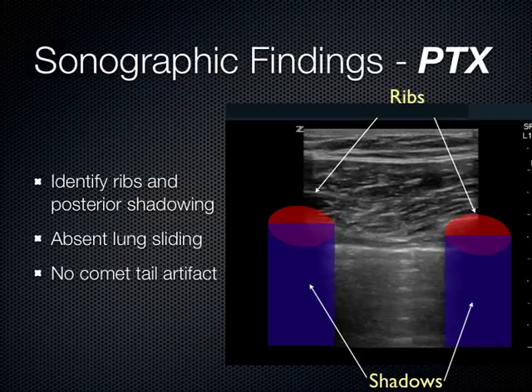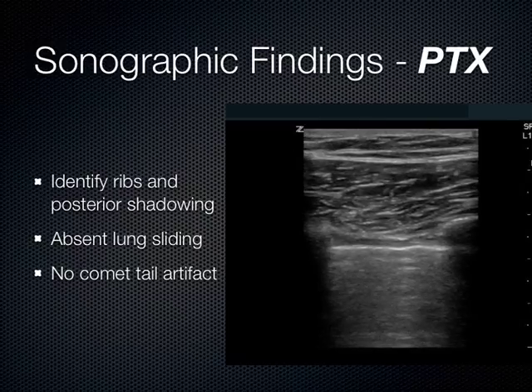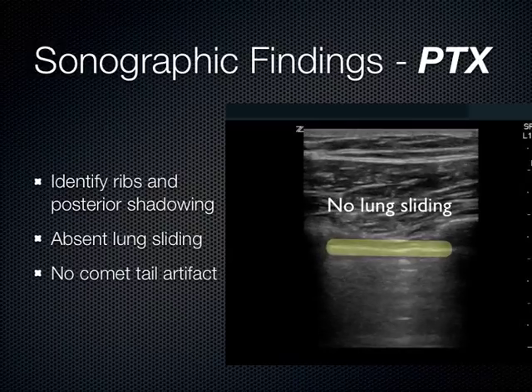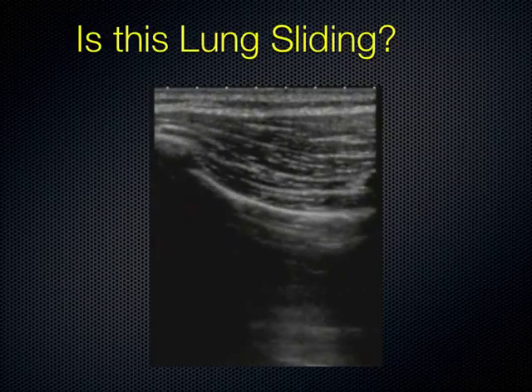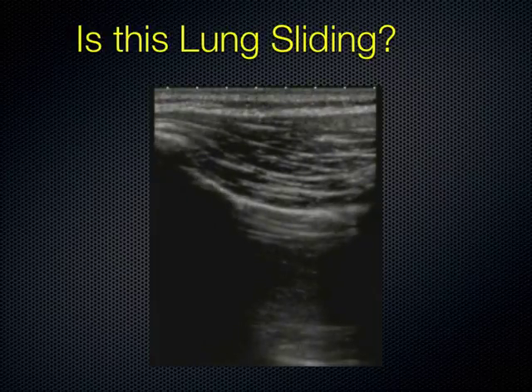Moving on. Just a couple examples. Is this lung sliding? So, pneumothorax or not? No. Good. You're experts now. That's really all you need to know. How difficult is it to get that image? Very easy to get the image. You will all be flying through this and then looking at kidneys and hearts later today, because it's very easy to get the image.